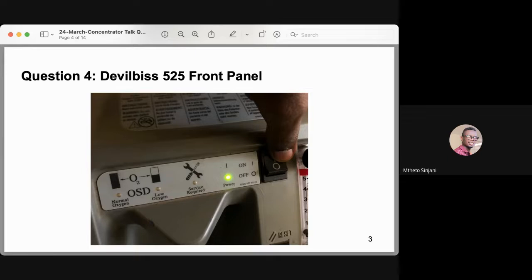It is supposed to happen every time the concentrator is switched on, to check that all 4 indicator lights and the audible alarm are functional. When the indicator lights illuminate or the audible alarm sounds other than during the startup itself, that means there is a problem occurring. The following are some of the problems.